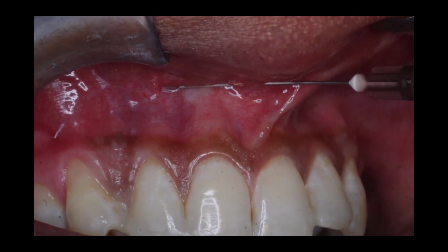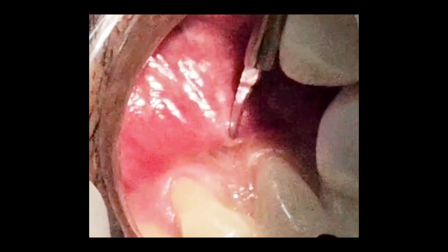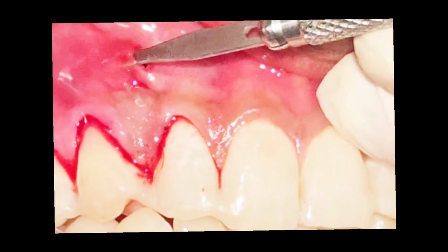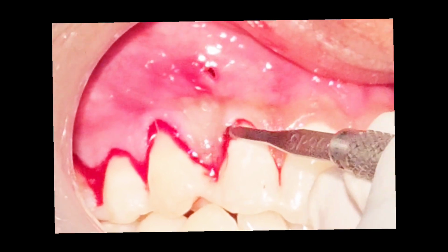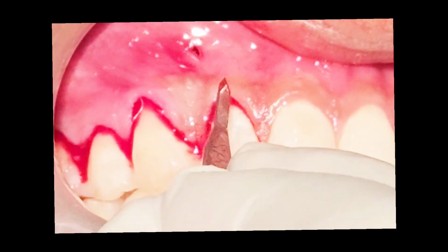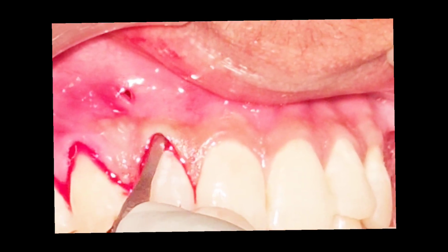First, the local anesthesia infiltration is given. Then, using a 15 number blade, we give a vestibular incision between the lateral incisor and the first premolar. Then we switch to the microsurgical blade to start the tunneling procedure to break down the fibers. Since we are combining both VISTA and intrasulcular tunneling, we use the same blade to incise through the sulcus. Here we are doing the intrasulcular tunneling for 1-2 from mesial to distal.